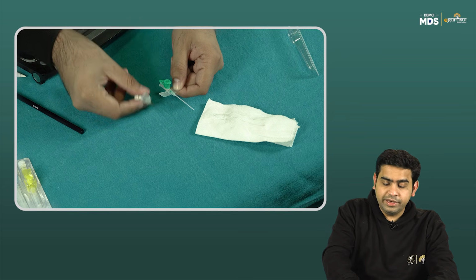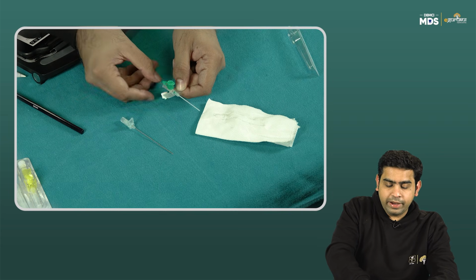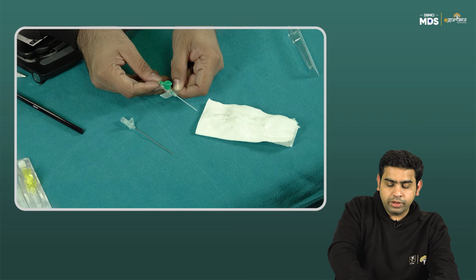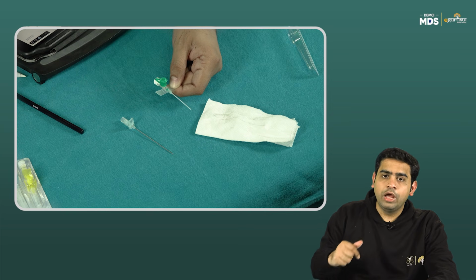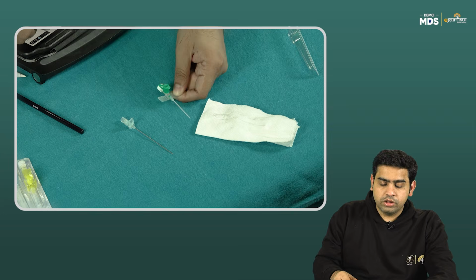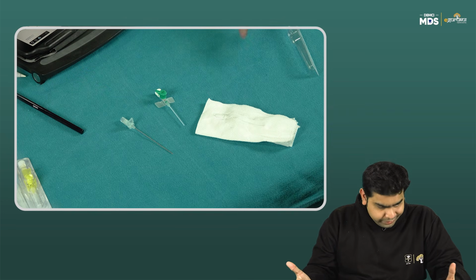So you remove this particular needle and keep the needle outside, and this luer lock, you apply the luer lock on the tip of this. So you apply this luer lock, that is a screw mechanism, over the tip of it, and now you fix this cannula to the surface. This is how you put it. Yeah, that's what it is.